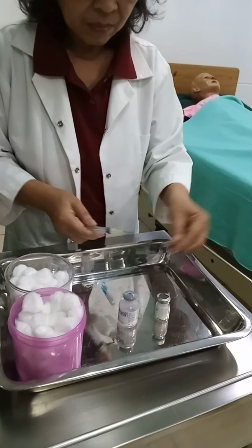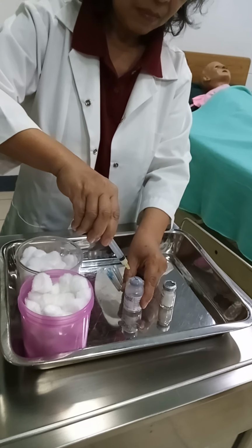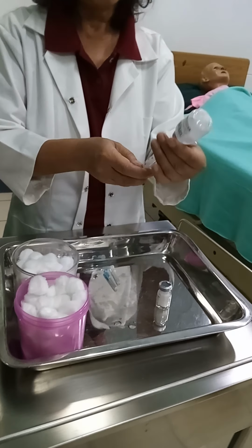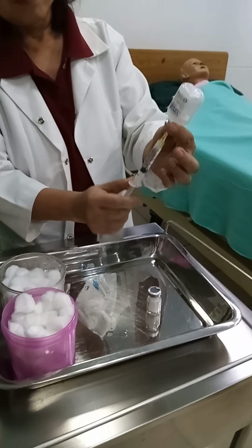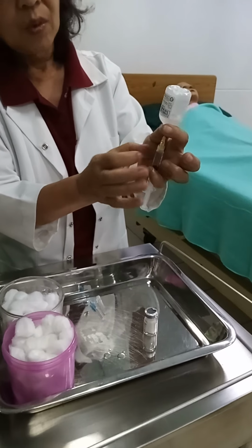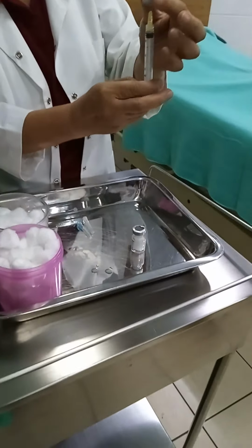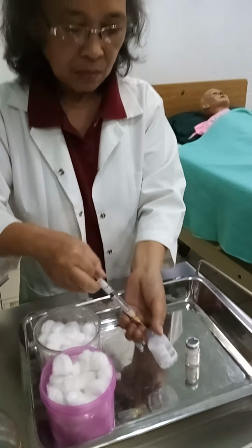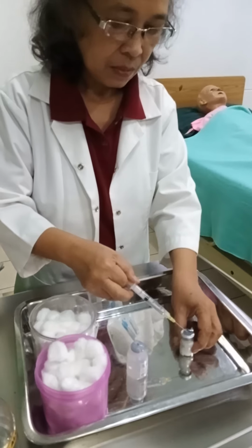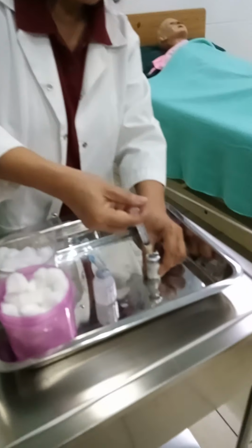Remove the needle cap from the syringe. Pull back the plunger to draw an amount of air into the syringe equivalent to the volume of medication to be aspirated from the vial. Set the vial on a flat surface and insert the needle tip through the center of the rubber seal.